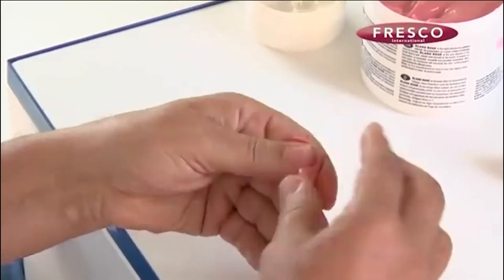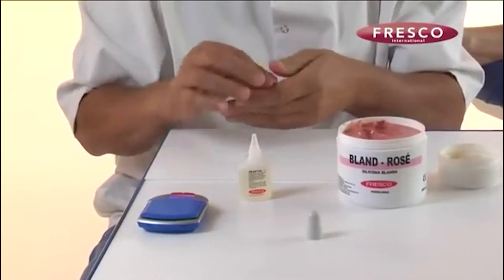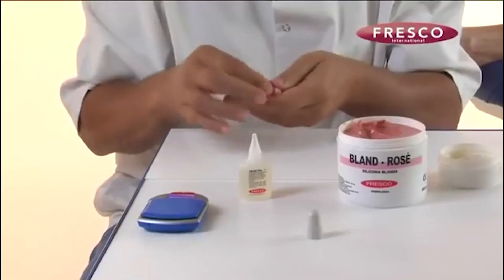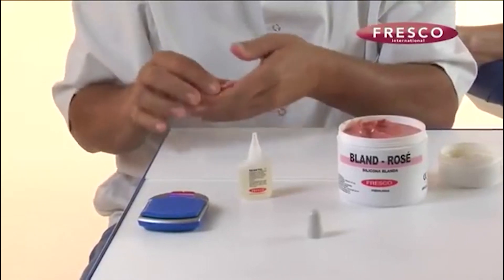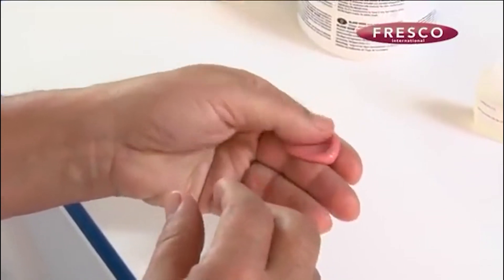Kneading of the silicon is recommended just before adding the catalyst. This way the silicon will have a smooth texture before making the orthosis. It is then placed on the fingers and a small hollow is formed where the catalyst will be added.